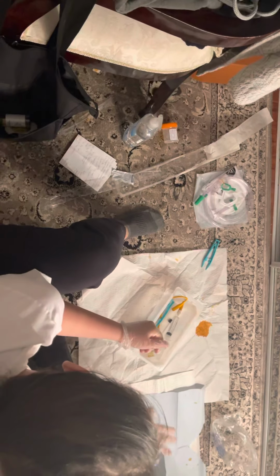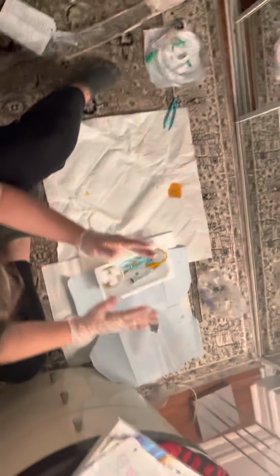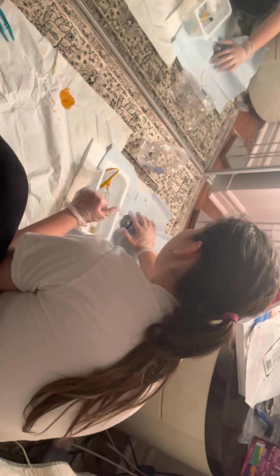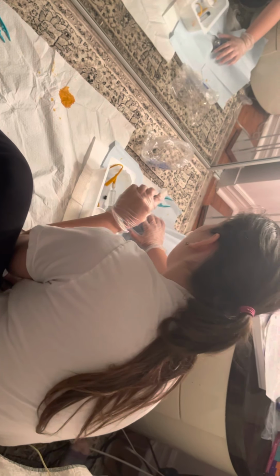So once I've done that, I'm going to take my kit and place it on the drape, which is sterile, right? So let's pretend I'm at the bedside. I'm going to begin by cleansing the perineum area. So I'm going to take my non-dominant hand, place it on the labia, and open the labial folds. I'm going to cleanse from the clitoris to the anus with a one-way stroke, starting with the labial folds and moving to the urethra with my cotton balls with betadine.